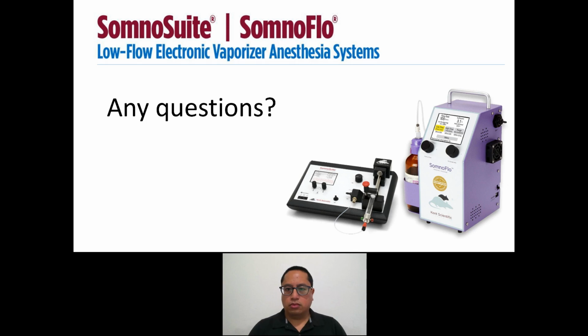Perfect. Okay. The next question here is, can I replace the plastic clips with plastic stopcocks? Hello, Anne. Good to see you. Can you replace the plastic clips with plastic stopcocks? There certainly is nothing stopping you from doing so. I did have a customer who mentioned that they did that and they preferred to use a stopcock instead of the plastic clips. So that is definitely possible for you.